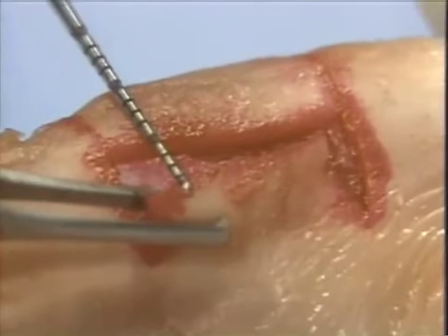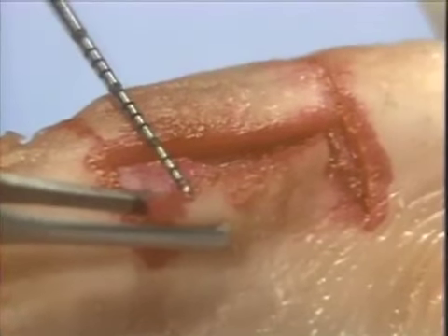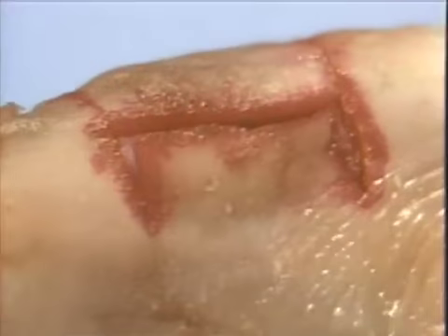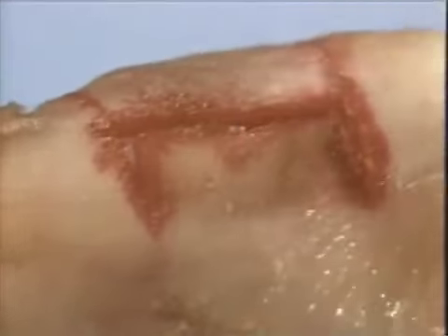The thickness of this flap is approximately 1.5 to 2 millimeters and can be compared to the thickness of the flap which lies to the buccal, which we will demonstrate as a full thickness flap.